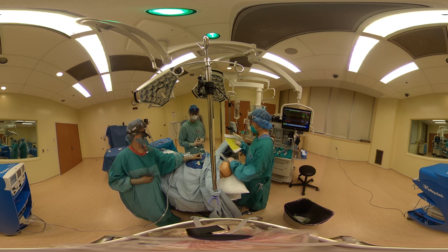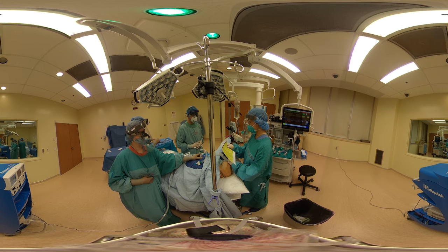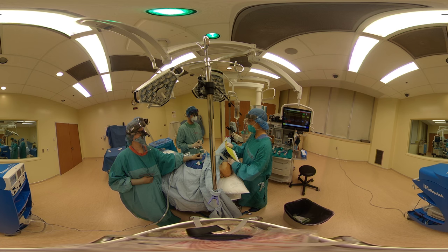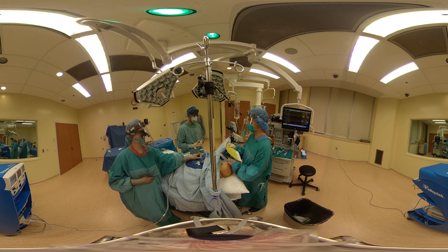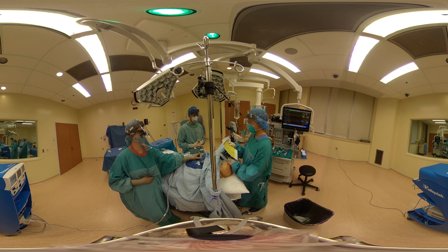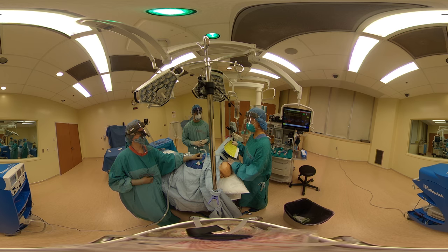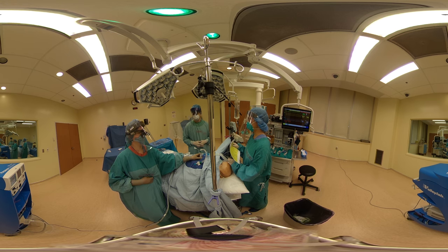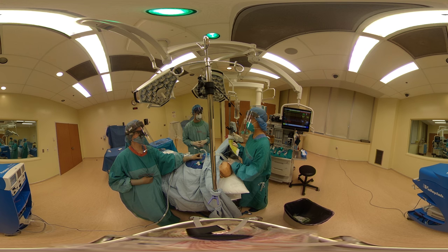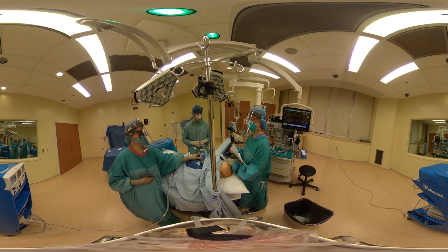We are not going to extubate this patient. I am going to take this patient to the negative pressure recovery room. Do you have a clean person who can come with me to the recovery room and help transfer this patient? Yes. We will stay gowned until we transfer the patient over to the bed, and then I'll go with my transfer person while you all dock out of the room. I'll have emergency drugs with me at that time as well.